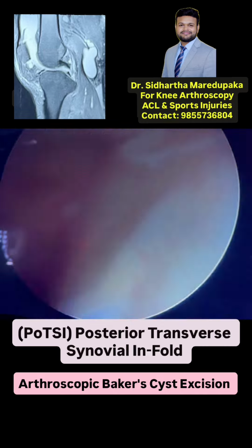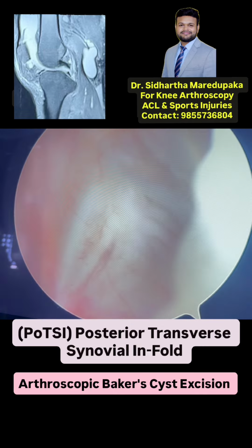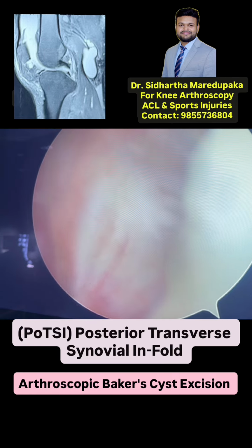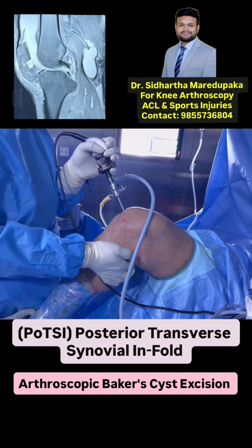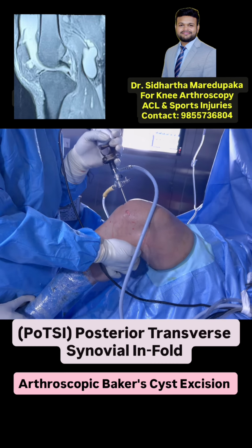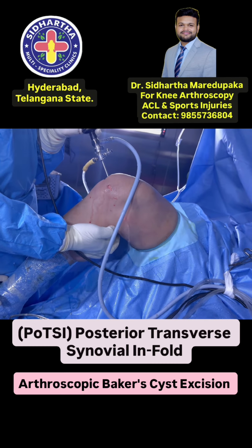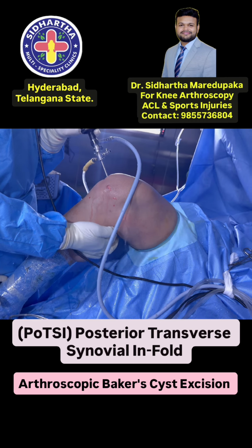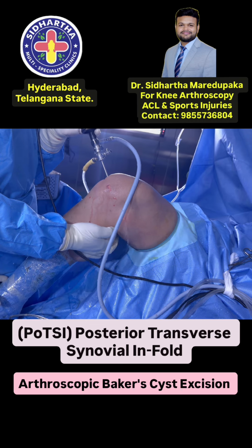So I can feel the skin. So this is my skin, and I'll show you. I'm palpating the skin. Show me this. This is my semitendinosus tendon. This is my hamstring. So right medial to the hamstring. Look at that. The moment I poke this, I'm right at the popliteal fossa, medial side. So I'm in the safe zone.